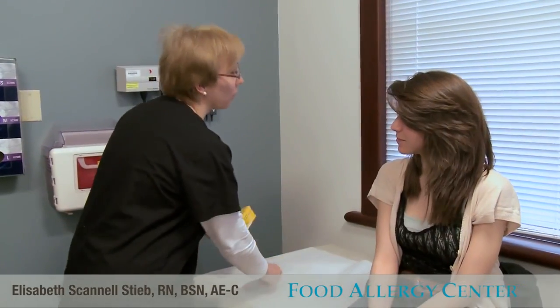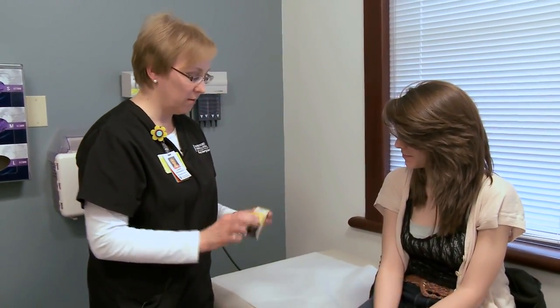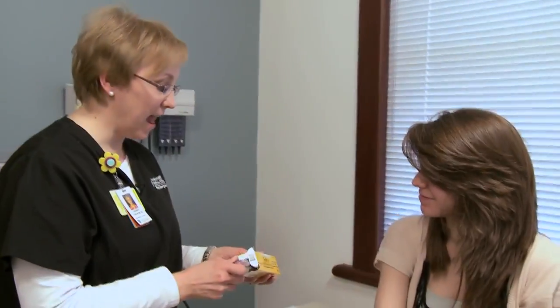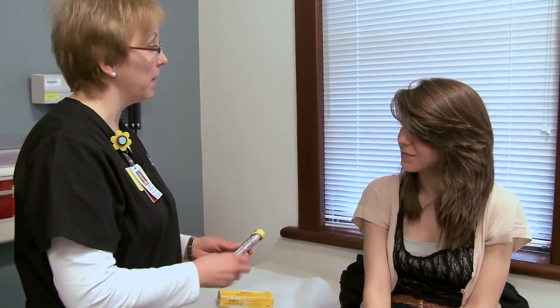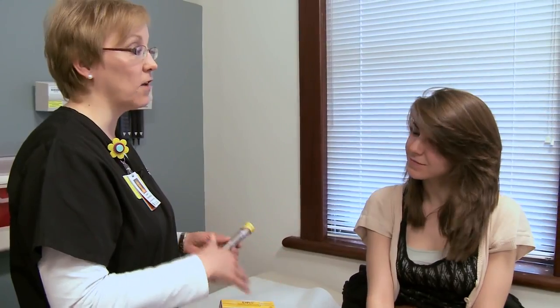Today I'm going to teach you how to use an EpiPen. I'll show you a real one first, and then we'll practice with the trainer. The EpiPen is a shot of epinephrine, and epinephrine is adrenaline. It's going to give you the side effects of adrenaline — your heart rate and blood pressure will go up and you'll feel jittery. Those are the major side effects, but they're also the purpose of it, and they don't last very long.